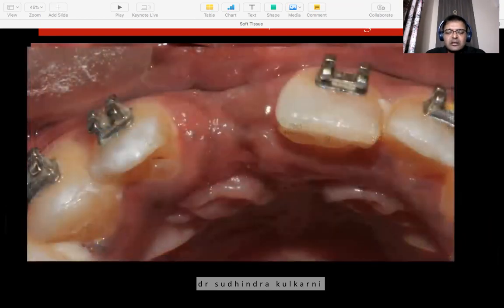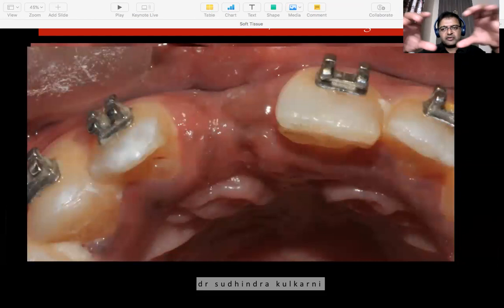You can already see here that after the extraction of this tooth, I don't know whoever had done the extraction, had compressed the socket. You can even see fingerprints of the guy who extracted it. Every time you compress the socket, that's what you would see. You see the scar tissue, the connective tissue, as the socket heals, it pulls the soft tissue towards itself, and you can see literally pulled tissue at the crest of this socket, or the site rather.